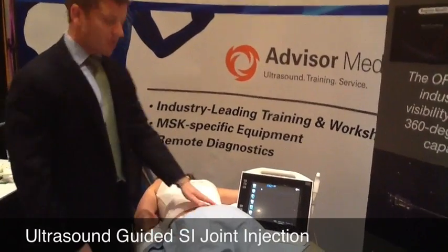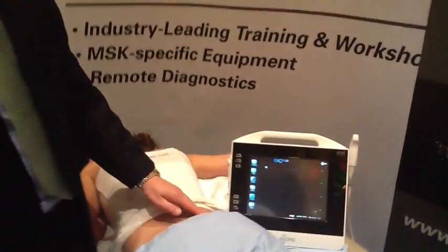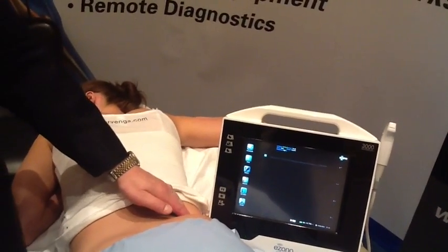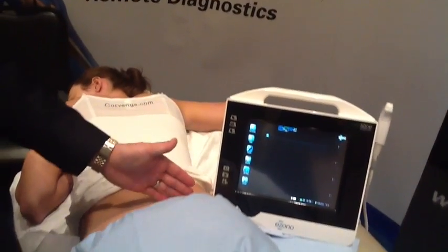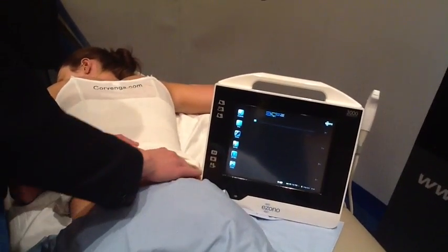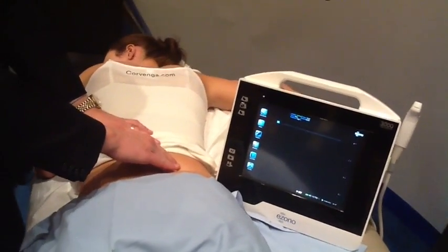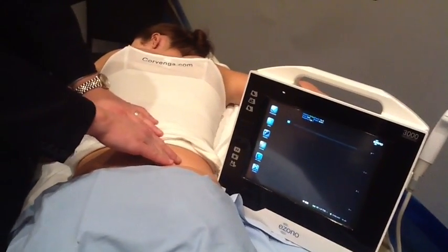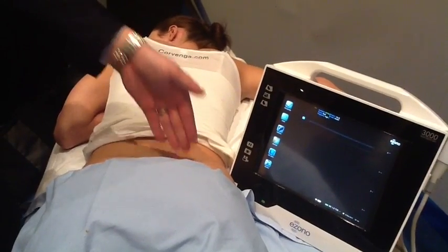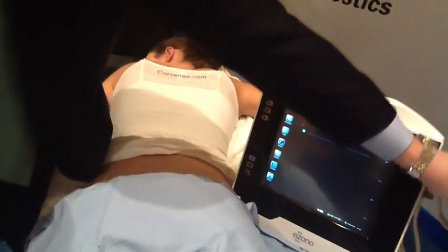The first thing we want to identify is the anatomy. There are a couple of different techniques: starting midline and going lateral, or starting up by the PSIS and scanning caudal to get to the lowest portion of the SI joint. To start out, you would start up more by the PSIS where it's relatively superficial, and then take your transducer and scan down. I'll show you using the EZONO 3000.